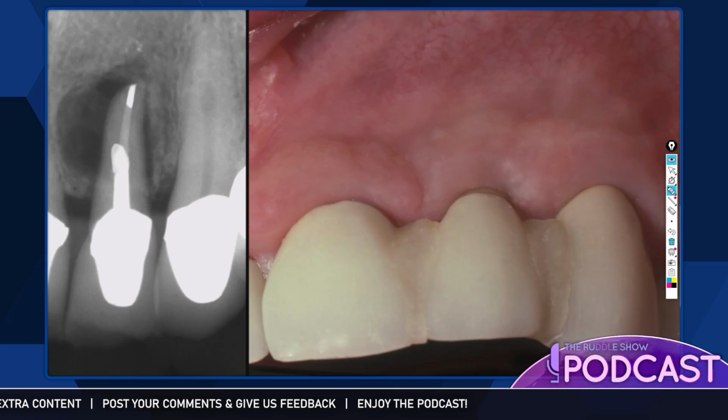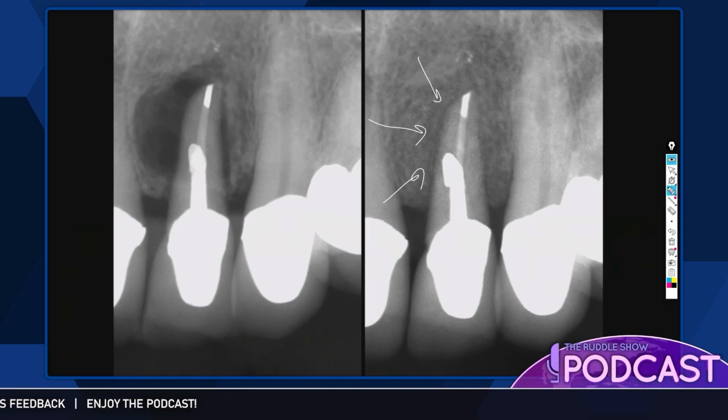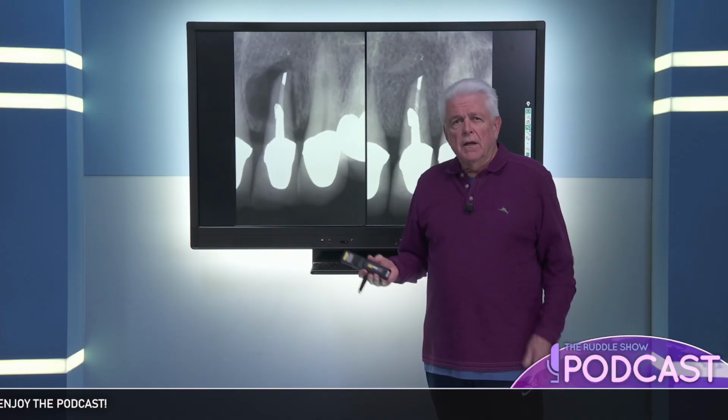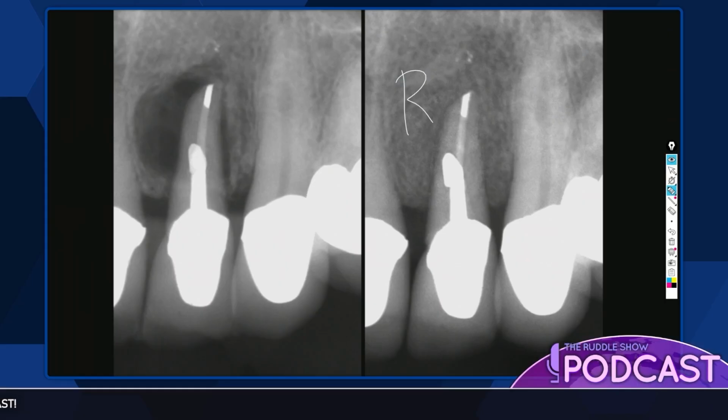So there's our post-op. And here we are pretty much down the road, and you can see how the bone comes in. You can see a tremendous osseous repair as compared to the lateral pathology. And I'd like to say a few things about soft splints. I've already explained why. I explained that it was Adaptic. I think I said to Hideki you could use Ribond.